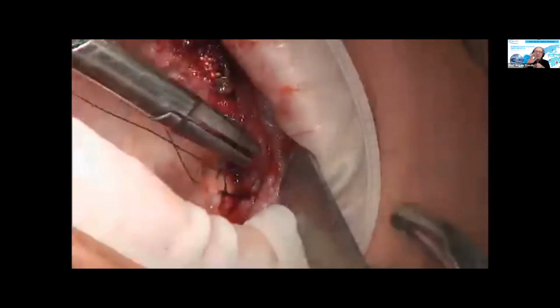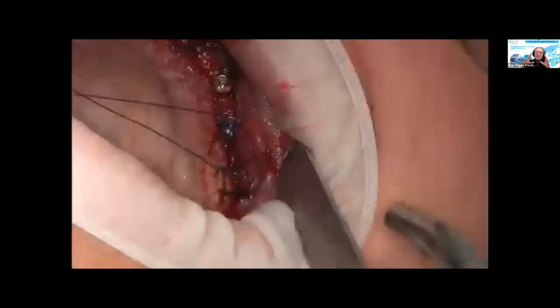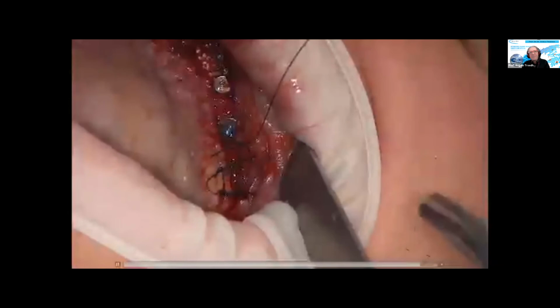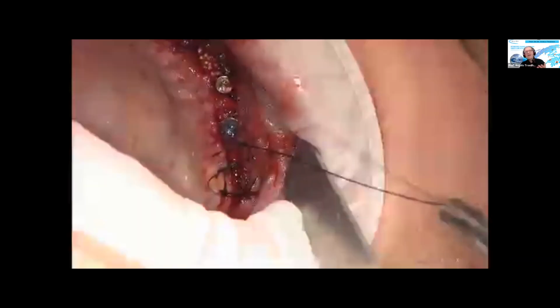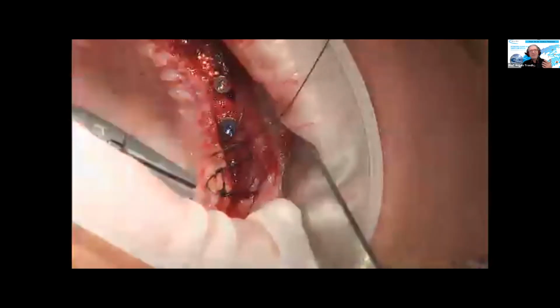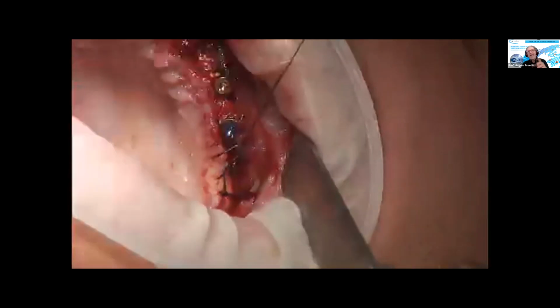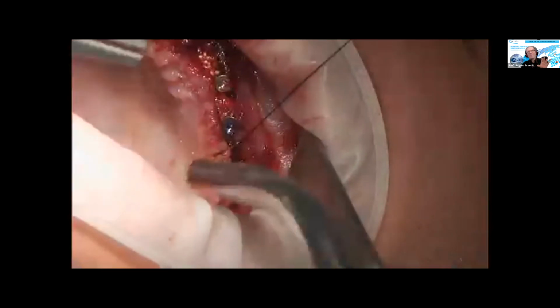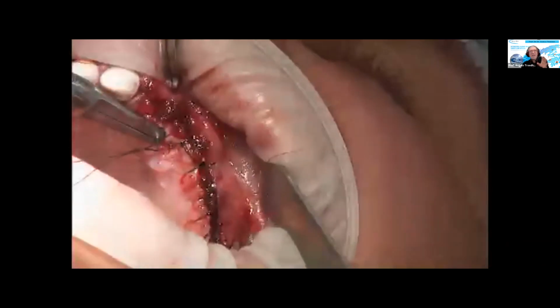So to overcome this problem, either you can do some stabilizing stitches, or you do a running suture like this with a loop, as you can see here. So you do one single knot, which has the big advantage. The patient has only one knot to play around with the tongue outside the original surgical area. And with the loops, they just sink into the soft tissue, so that the patient is not really motivated to do this.